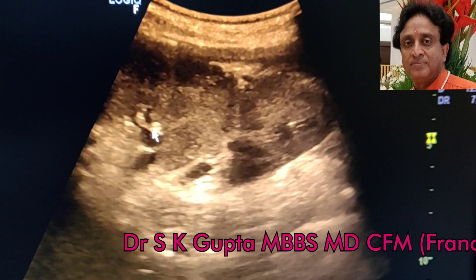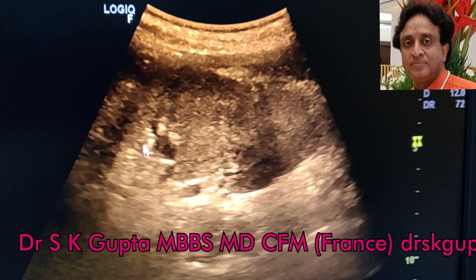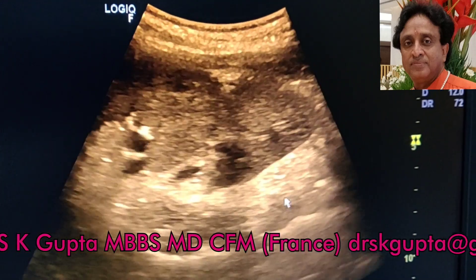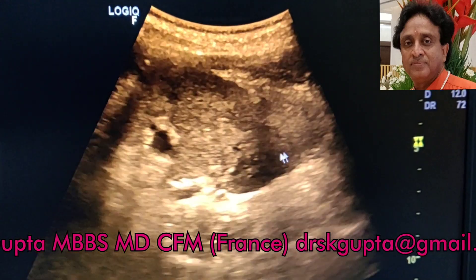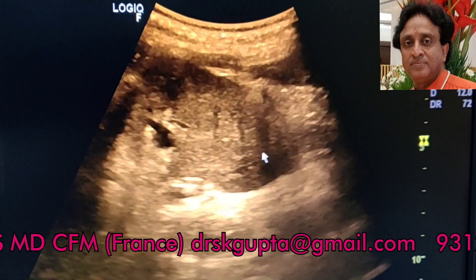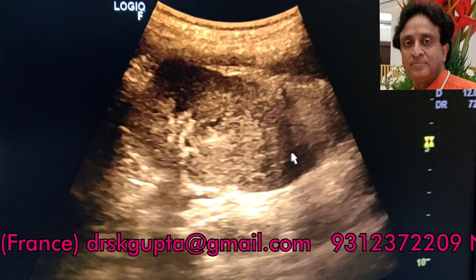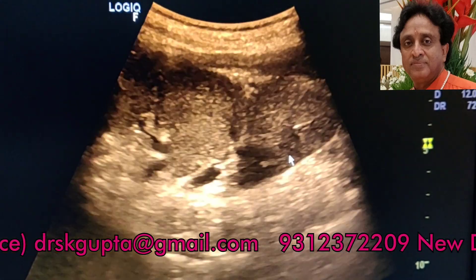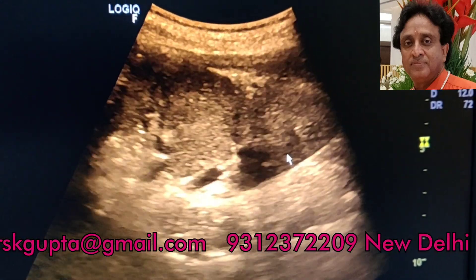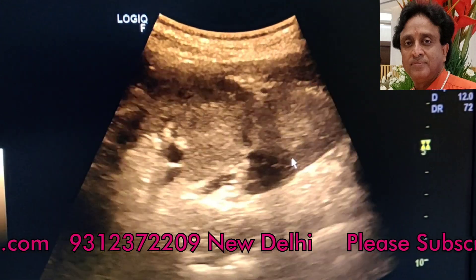Both kidneys appear to have different pelvis — one pelvis here and another pelvis here — so it is quite likely that these two kidneys are separate kidneys which appear to be fused, confirming this as a supernumerary kidney.